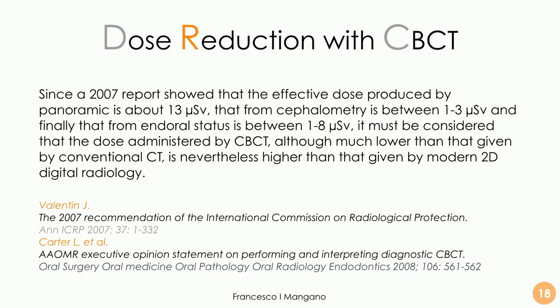And we have a dose reduction that is absolutely out of discussion, and we have a variability between the different machines and between the different protocols among the different cone-beam computed tomographies, because along the years a lot of machines appeared in the market with different characteristics, different features.